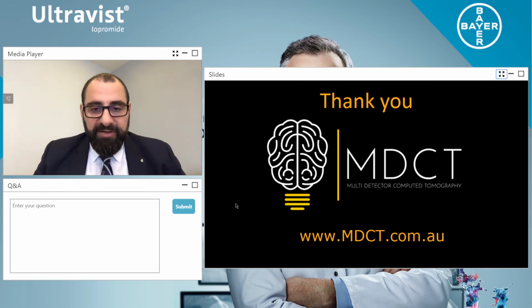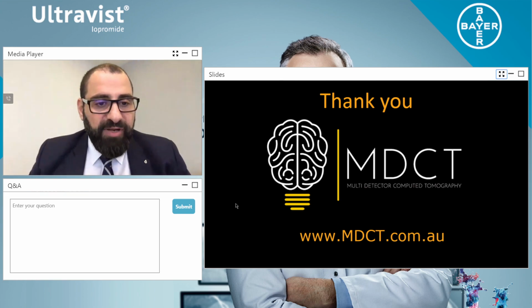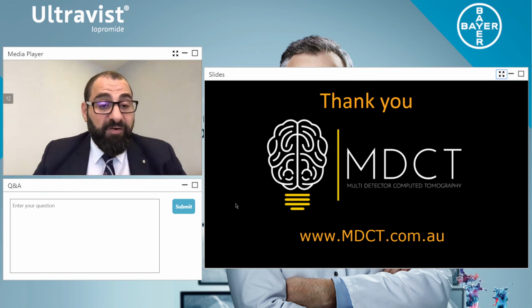Mohammed Amir, for liver imaging, are you preferring arterial phase or late arterial phase? So Mohammed, I really believe that late arterial phase for oncology is perfect. If you're doing liver transplant imaging, you should do early arterial phase.